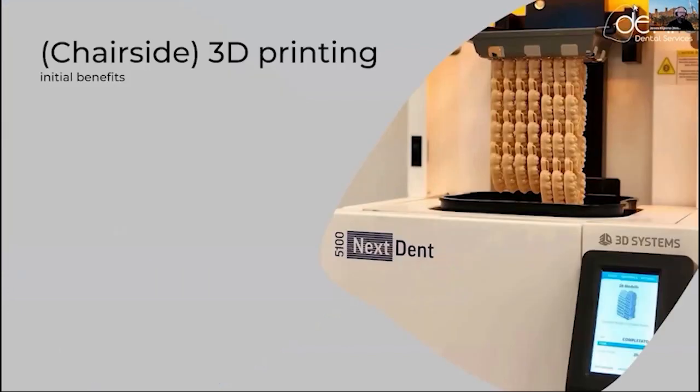And if we talk about 3D printing, what are the initial benefits? Whether it's chairside or in the lab, it really doesn't matter that much. We have a huge amount of benefits of 3D printing. One of them is that we are using a high accuracy technology. We know what we can get as long as our equipment is clean and properly calibrated. I keep hammering about that within our company, like everything is spotless. Our lab is so clean you can eat off the floors. I find that very important.